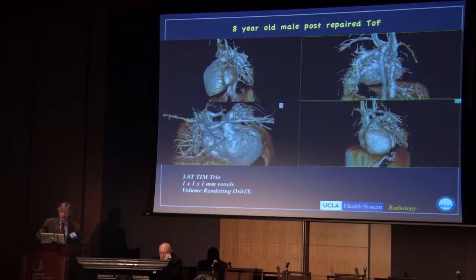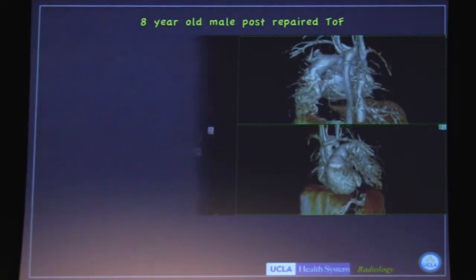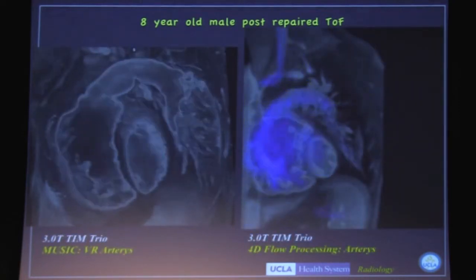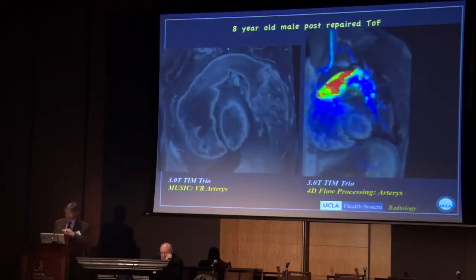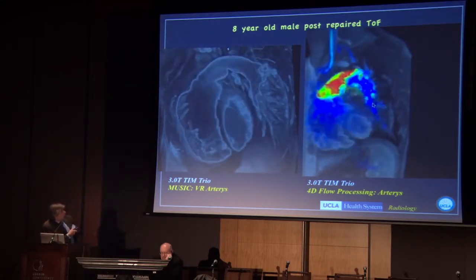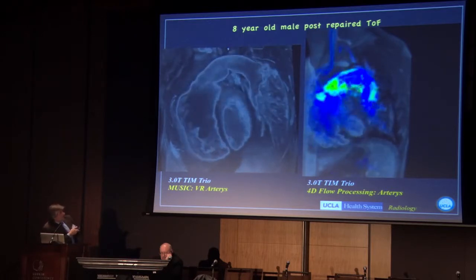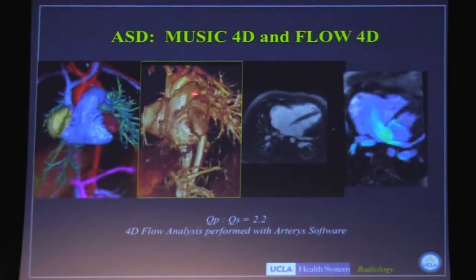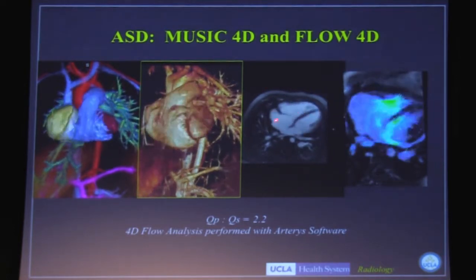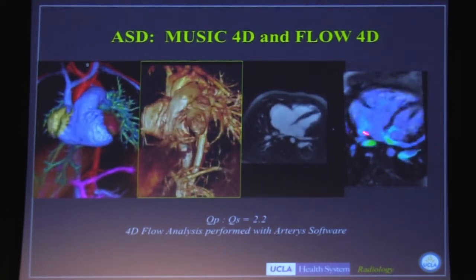Here's an eight-year-old, also post-tet repair. Notice how pulsatile the pulmonary arteries are here. Another very powerful feature we can add is the measurement of four-dimensional flow. Pierangelo mentioned measuring flow in two dimensions earlier. With the same approach, we can do high-resolution MUSIC imaging and then lower-resolution but still very helpful flow imaging. Here we can see free regurgitation across the pulmonary valve. Here's a patient with an ASD — the images on the left are MUSIC with color rendering and without, and here we have the 4D flow measurement showing free flow across this ASD.